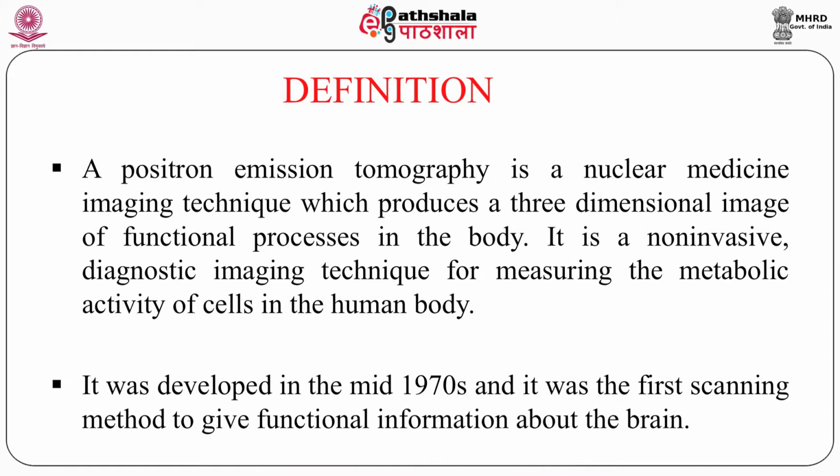So when we come to the definition of positron emission tomography, it is one of the nuclear imaging techniques, because we all know there are many imaging techniques available like CT, MRI, conventional X-ray, digital X-rays. And when you talk about nuclear medicine, there is conventional nuclear medicine, gamma camera, SPECT. But this is one of the advanced imaging technologies where positron is used. Here we are going to get the images, or you can say detect the disease, at the cellular level. This is also called cellular imaging or molecular imaging.